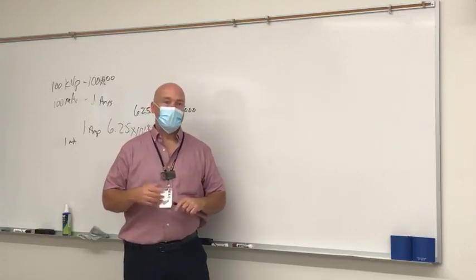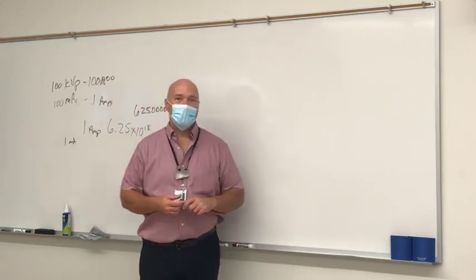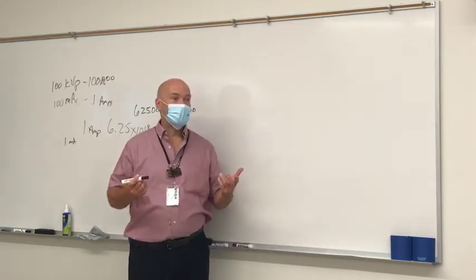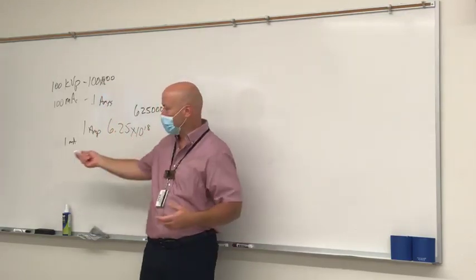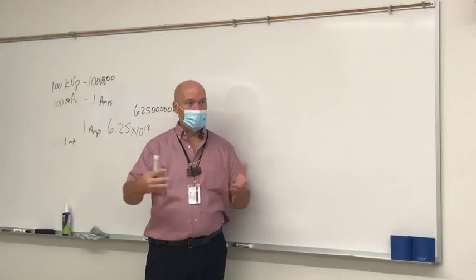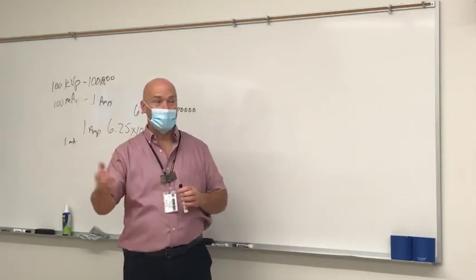So, for example, a chest x-ray technique may be 110 kVp at maybe 3.5 mAs. So very high kVp, low mAs. mAs is milliamperage seconds. It's the overall number of electrons we send.